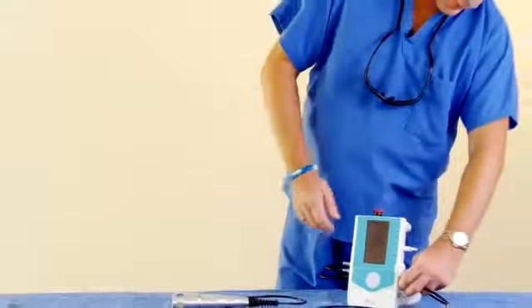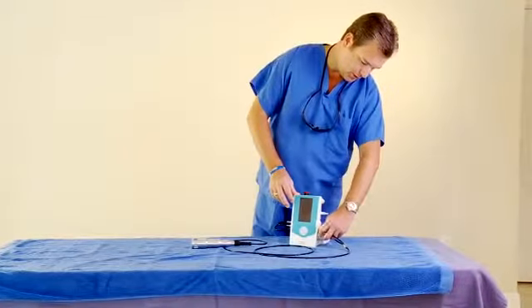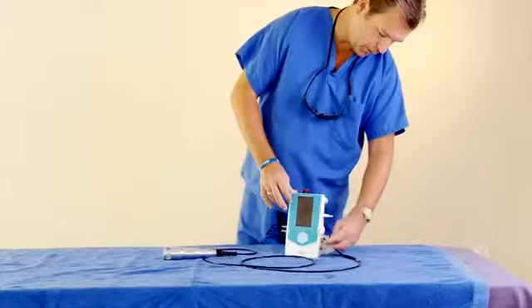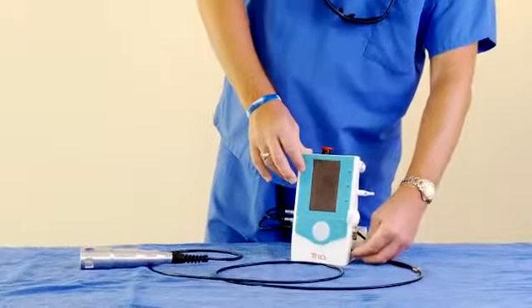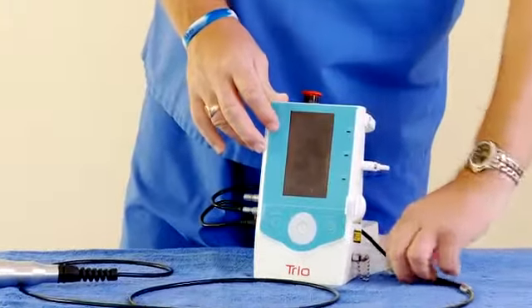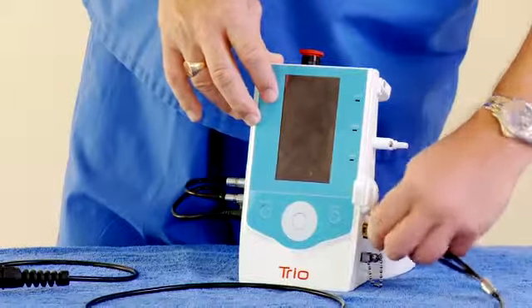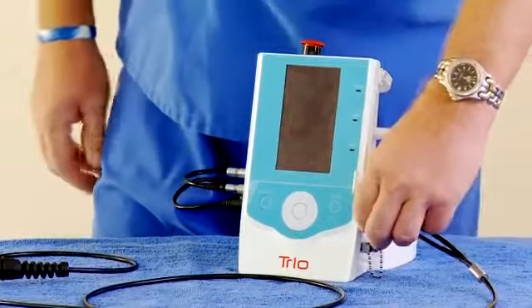And on maintenance on the other side, make sure your optic fiber, when you disassemble, is covered. That's what this cap is for in the instructions, and that'll keep your diode clean and dust free. You can use your cleaning kit on the end a little bit, but definitely keep this covered and clean and dust free. If you don't, the optic fiber will eventually burn out.